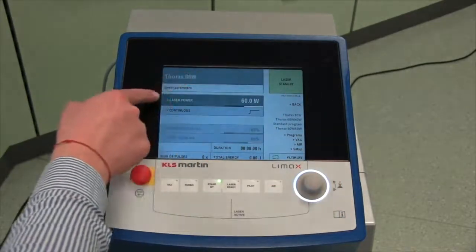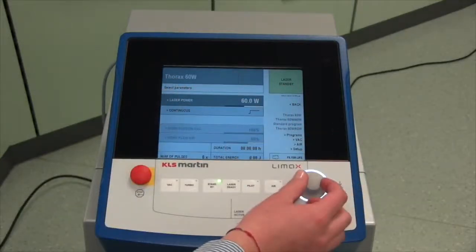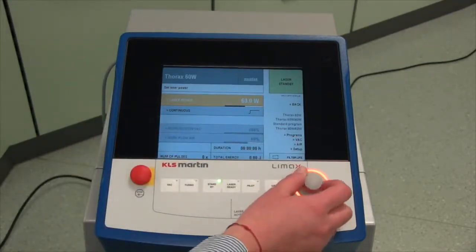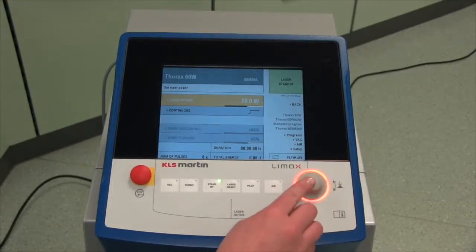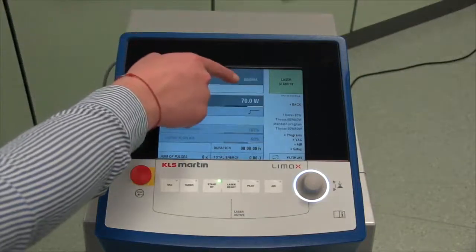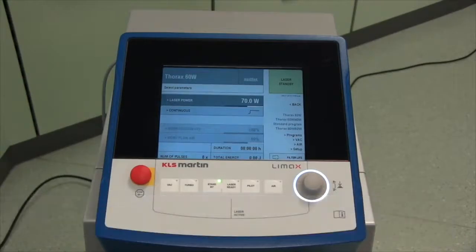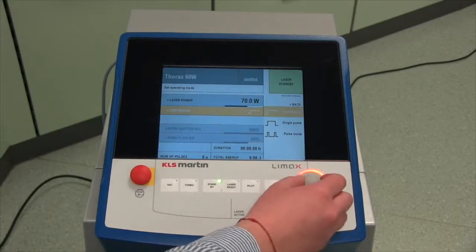The laser power section on the upper left hand side of the display shows in dark gray color. Press again and the active field is highlighted in orange color. You can modify the laser performance by turning the rotary knob. Confirm the modifications by pressing the rotary knob. The upper right hand display section shows now Modified. The procedure is repeated for the remaining parameter settings.